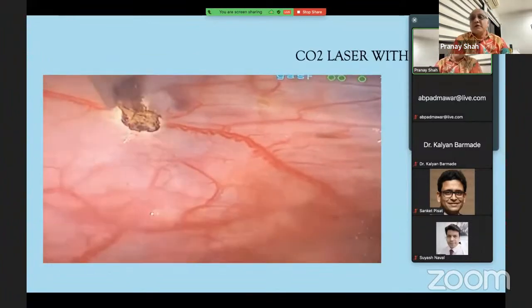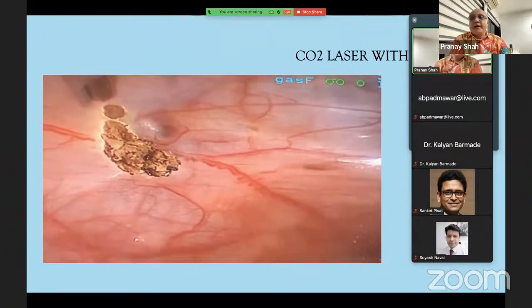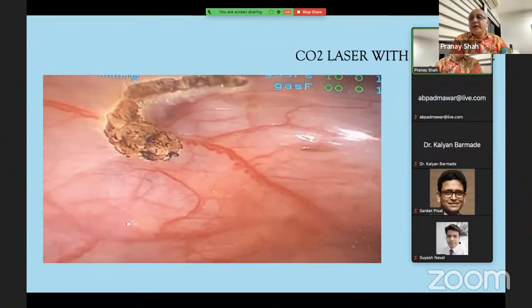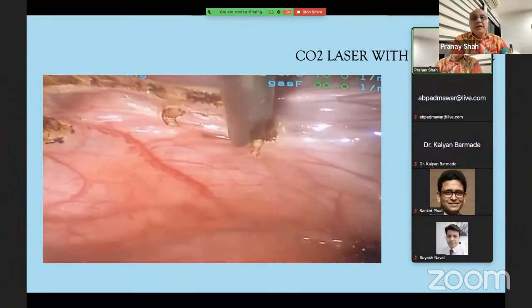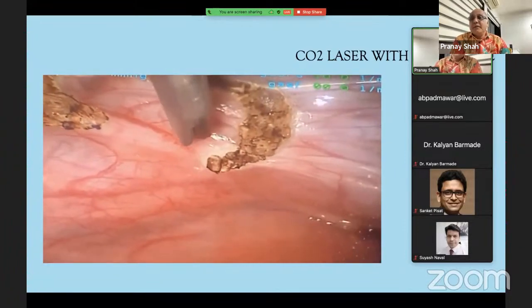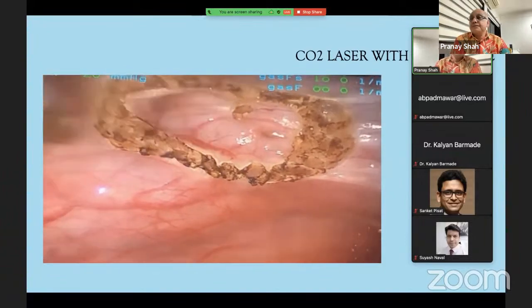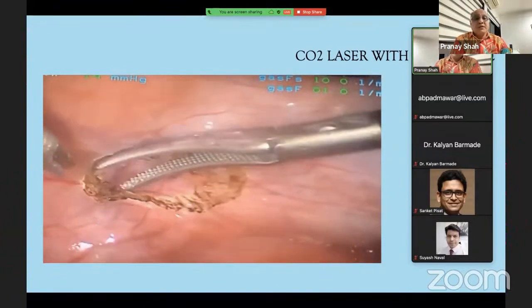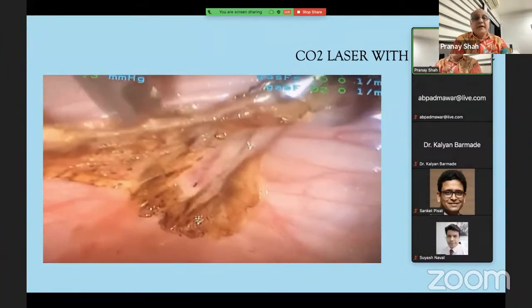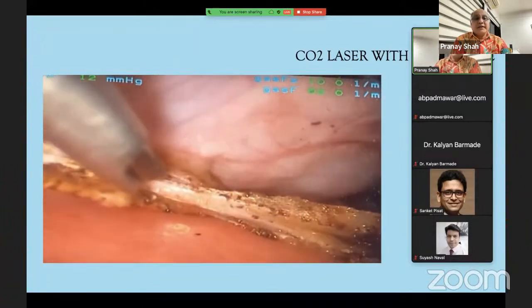In this video, carbon dioxide laser fiber or an Omni guide is used to treat endometriosis. A series of dots or craters are created, joining to make an incision. Small vessels are sealed, thus giving a clean, bloodless field. Once the lesion is completely incised, the lesion can then be dissected free from the underlying tissues using the dissection technique.